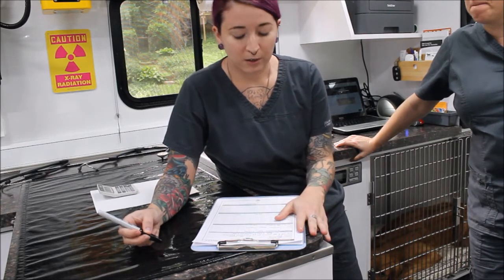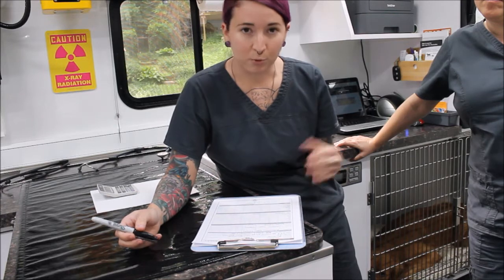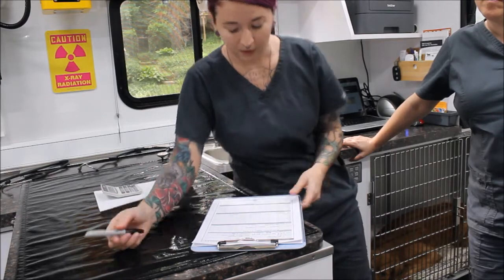We're going to give him his butorphanol IM 15 to 20 minutes before the procedure, before we induce him with the propofol. Then we'll maintain him on the isoflurane, the doctor will perform the castration, and then we'll recover him. He'll stay with us for a little while before going home with the owner.